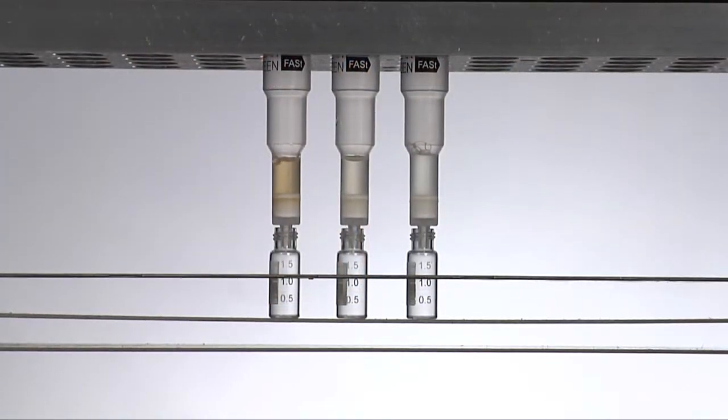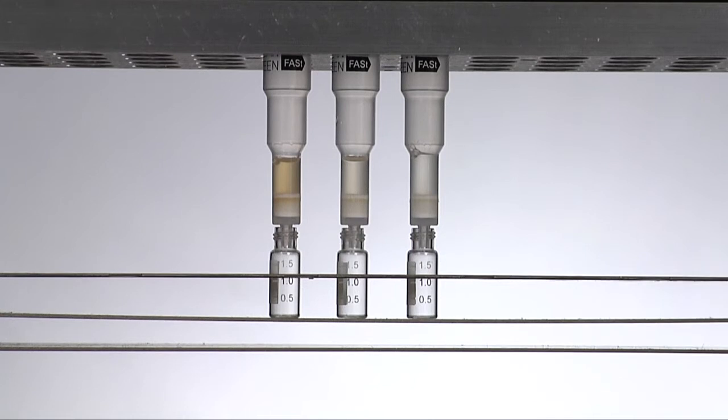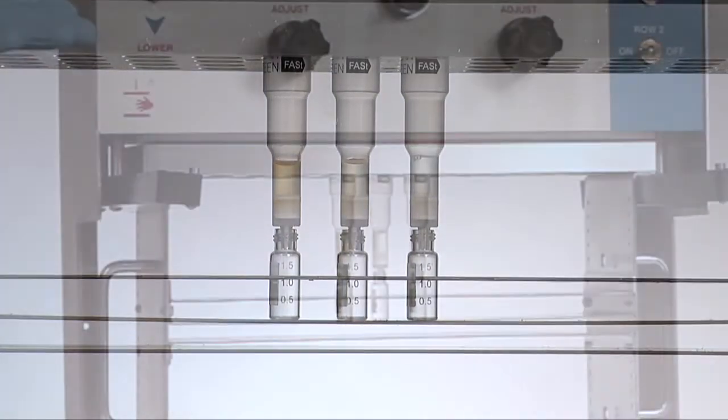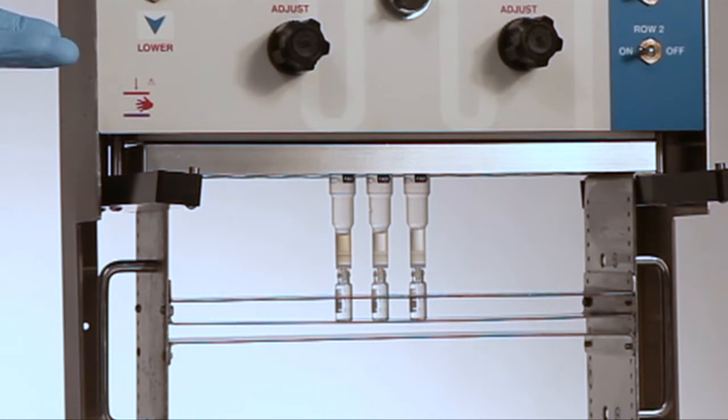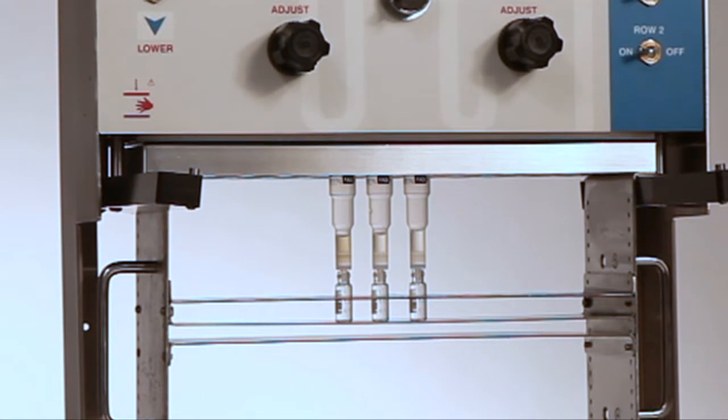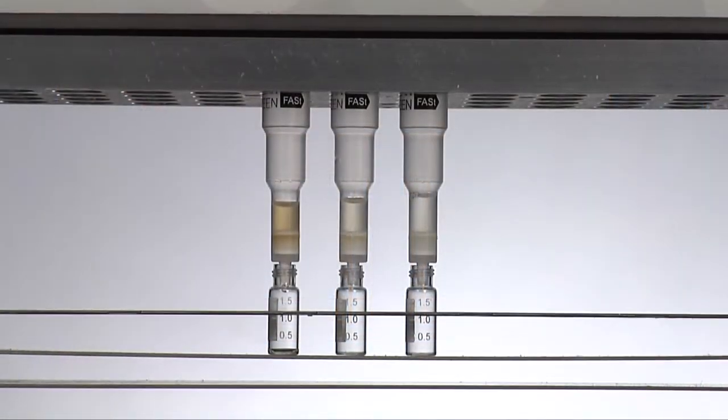Immediately you can see the samples are getting pushed through. What this is designed to do is take out any unwanted matrix, as you can see immediately on the cartridge to the left where the brown color, which is the matrix from the sample, is adhering to the sorbent.